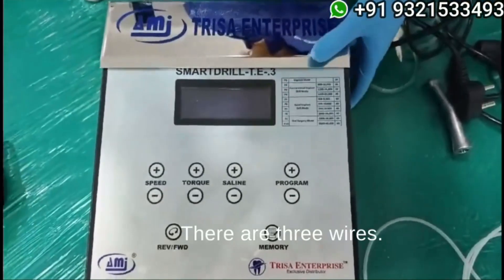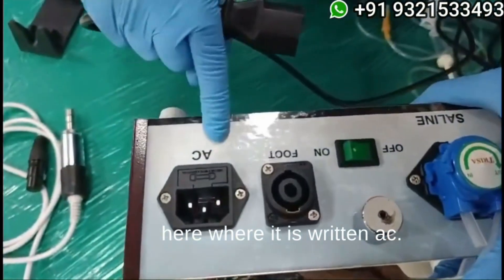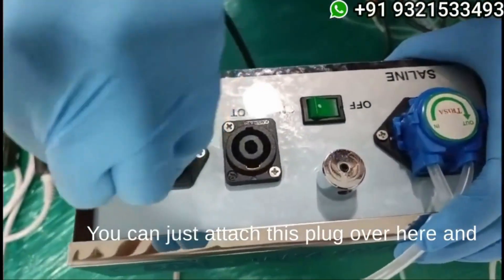This is your dispenser. There are three wires. The first wire gets attached over here where it is written AC — you can just attach this plug over here.